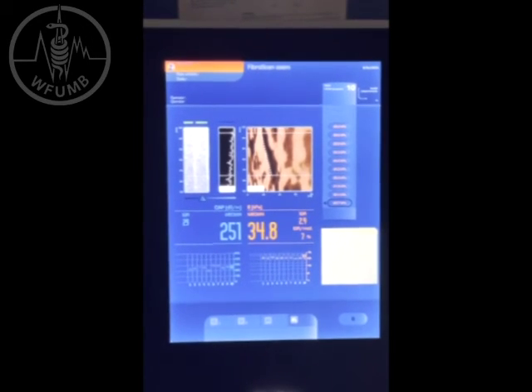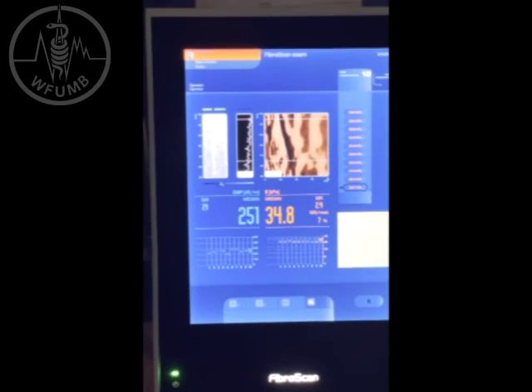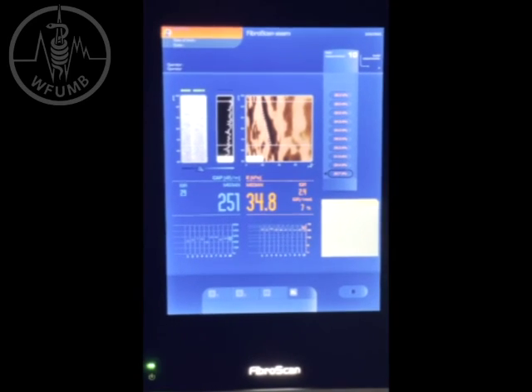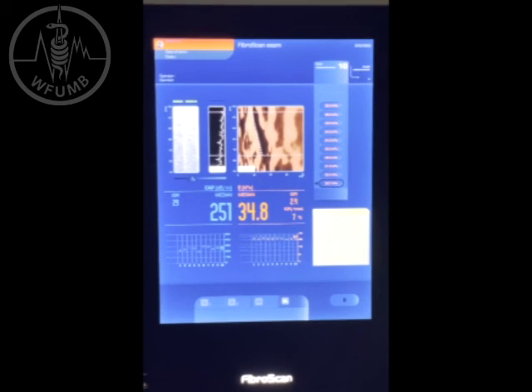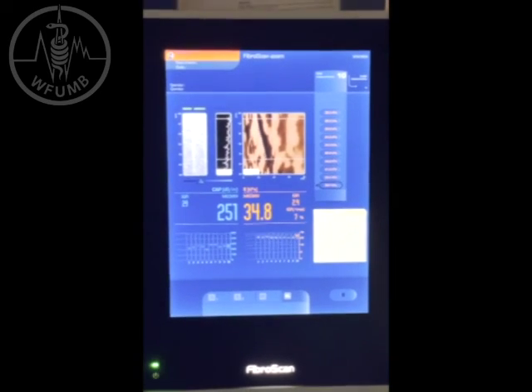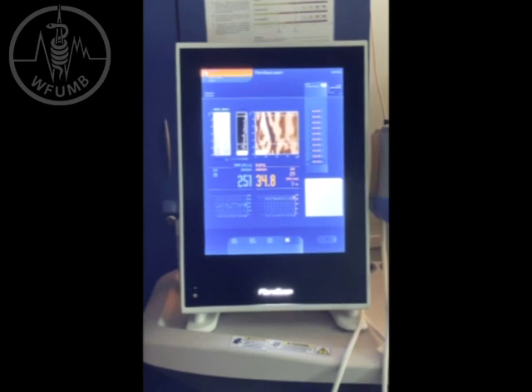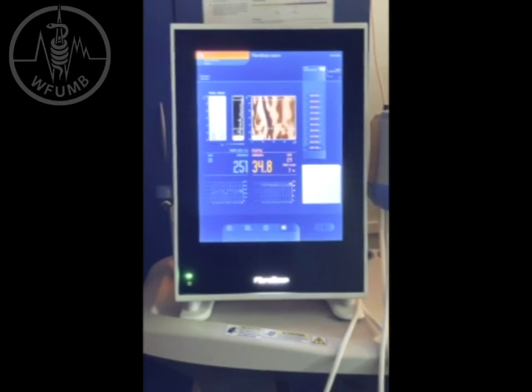Judging by the most recent meta-analysis that appeared in the literature, this value is indicative of maybe mild steatosis or no steatosis. Unfortunately, we do not have an ultrasound machine here, so we cannot perform a visual objective assessment of the steatosis in this case.